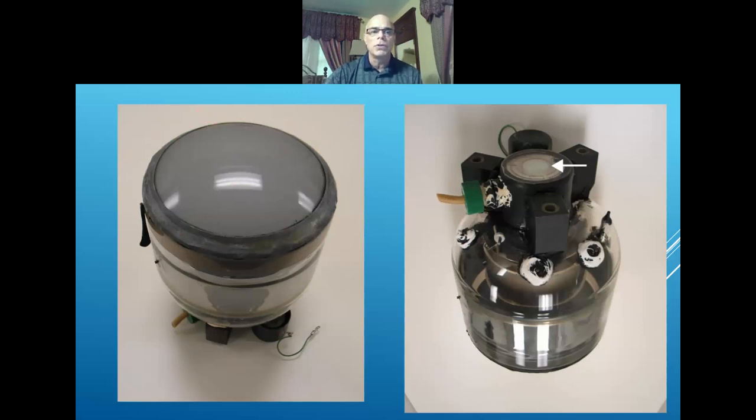This is made out of a certain type of chemical. Remember we talked about phosphorescence, fluorescent. It's got a material coated over it, but I'm not going to get into that quite yet. I just want you to appreciate the fact that this has got a huge input lens, and then we have a very small output. So the idea behind this is called an image intensifying tube. We're trying to intensify that very dim image that we talked about with the development of fluoroscopy. Remember the radiologist staring directly into the beam, looking at this very faint green-looking fluorescent image. We're trying to intensify that.